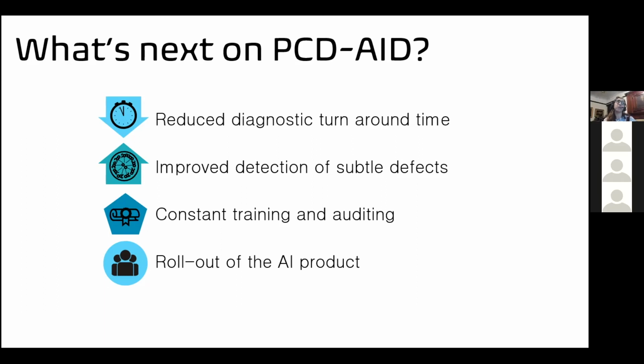And for the machine, if we have the images, it takes minutes. And it's very important when I say if we have the images, and I'm emphasizing this because obviously it takes time to collect the images, but that's why we are in parallel trying to create a way to acquire the images in the microscope in an automatic way. So automatization is the key.